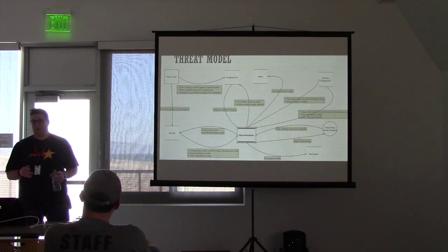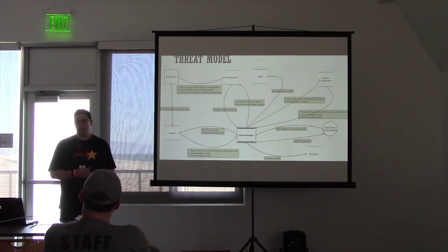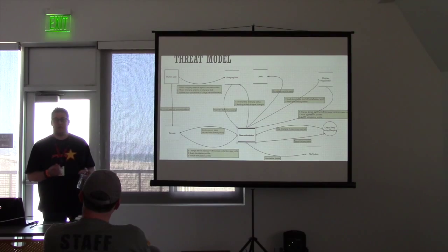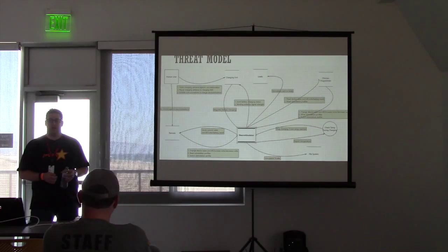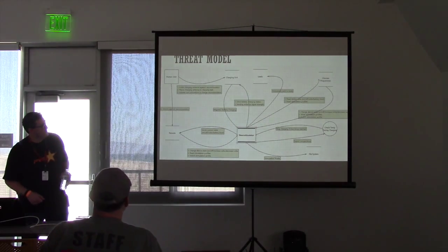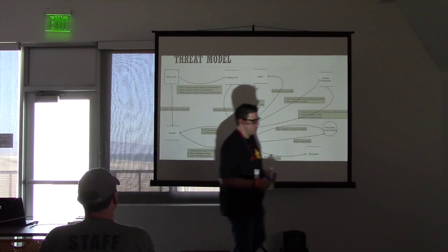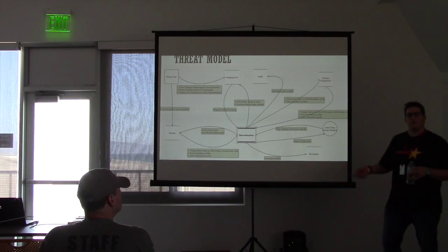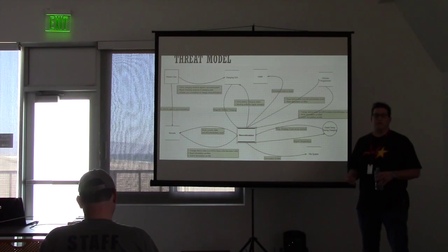So there's a benefit there in that you probably don't need to change pain management programs very often, but it can't be done wirelessly. So, well, it's done wirelessly, but it's done from a half-inch away using a device that is very expensive. And yes, you potentially could do it as a researcher, but you still have a very limited range. And is the software itself secure? Like, is that device where the software is recalibrated or calculated? No, not at all. So that's where you have to balance the insecurity versus the likelihood of that attack, even if they did crack that.